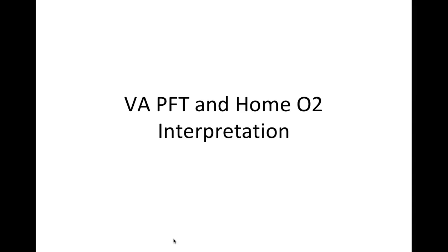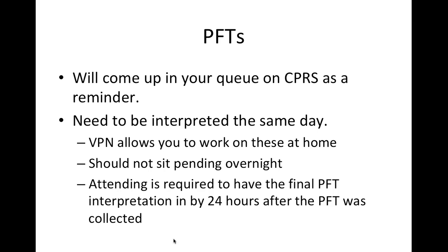This orientation is meant to help you get started with pulmonary function tests and home O2 test interpretations. As far as PFTs, these will come into your queue on CPRS within your view alerts. These need to be interpreted the same day.